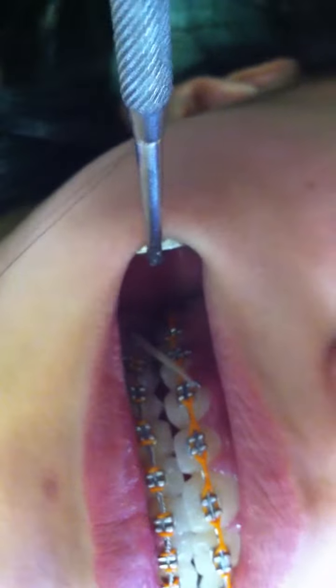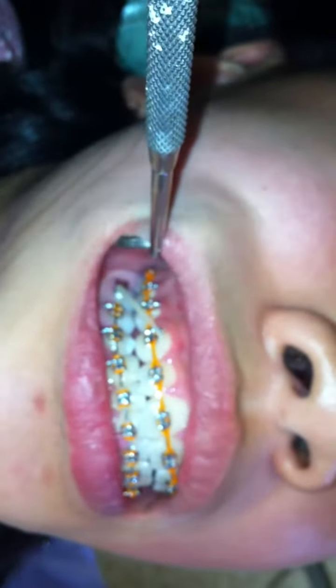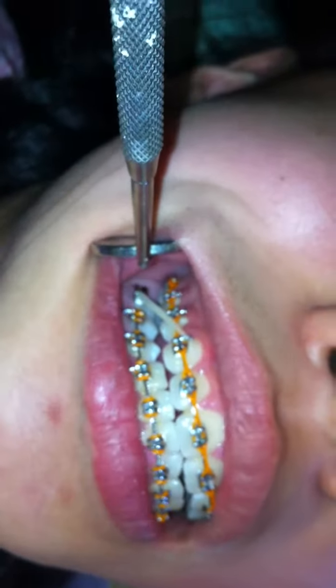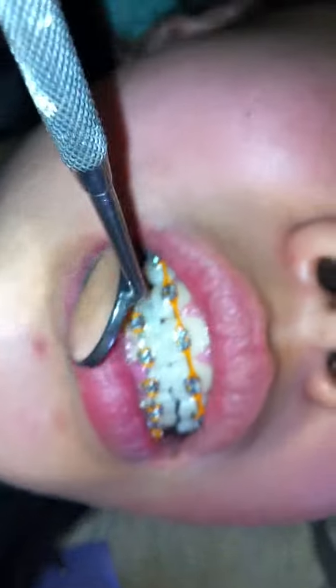If we go to the back section here, you'll see — I'll just turn the light on if I can. See the back section here? You can see how there's a little gap in the back now. And there's the elastic that keeps the jaw forward so it doesn't fall back.